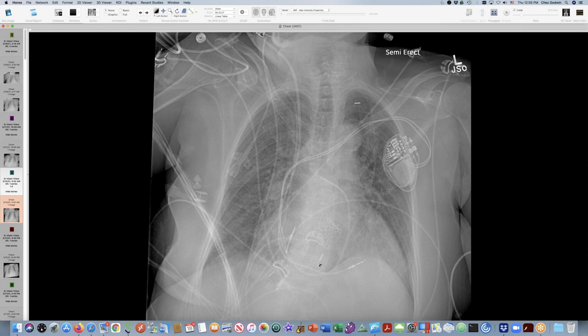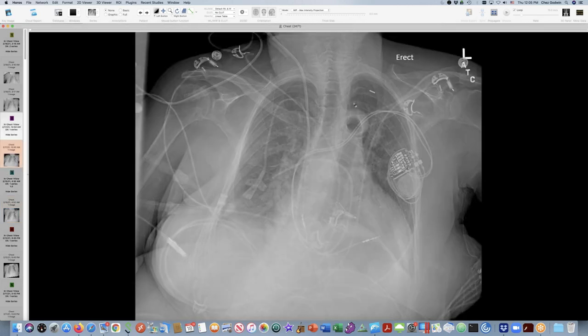This intra-aortic balloon was put in from the axillary artery, directed downward. The faint part that goes beyond the dense metal clip tells us that this is the actual tip of the catheter — the distal aspect, not the proximal as you might assume from catheters put in from below. This is the first time I've ever recognized the gas in the line going to the intra-aortic balloon. But you don't want what we saw in this case — the balloon inflated and extending into the subclavian artery.